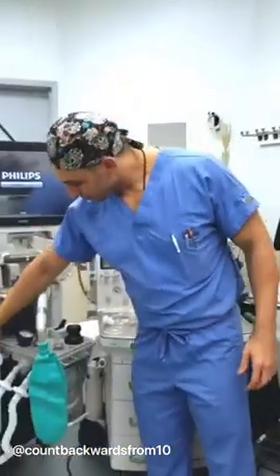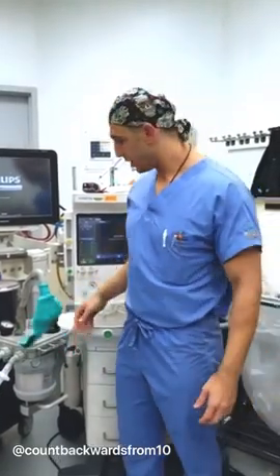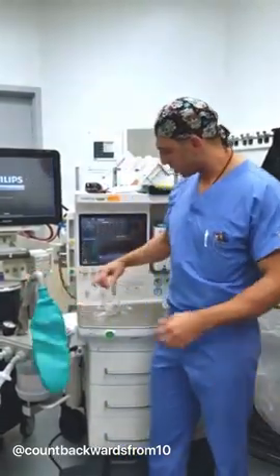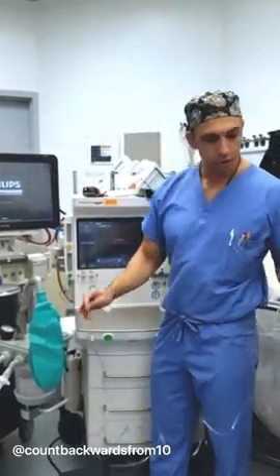Hey everyone, in this quick video from Count Backwards from 10, we're going to go over the balloon trick for making a portable oxygen tank out of your balloon. You're going to need the elbow for the circuit and the nasal cannula, which you're going to plug in.